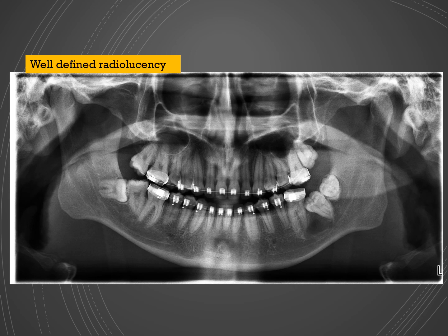Radiopacities, moving on to another radiolucency is this particular tooth, which was also in a patient who was getting orthodontic treatment done. You can see that the 7 is also submerged in the oral cavity. We're talking about the 37 here, and the radiolucency associated with it, which could be an OKC or an ameloblastoma on the radiograph. So it's impossible for us to very clearly tell whether it's an OKC or an ameloblastoma. Histopathology would have to be done for confirmation.